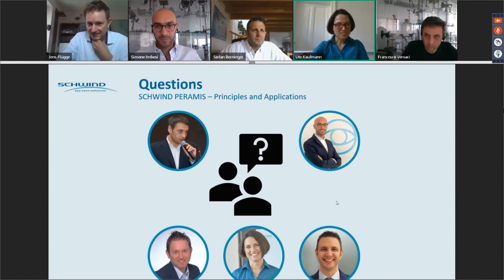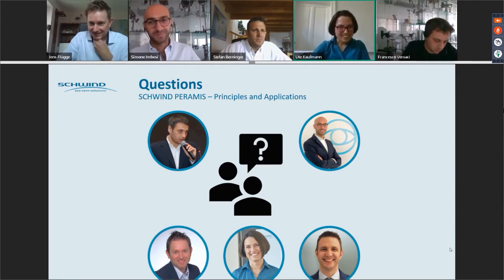Well, this is related to customized ablation, which will be topic in our next webinar. Let's see.